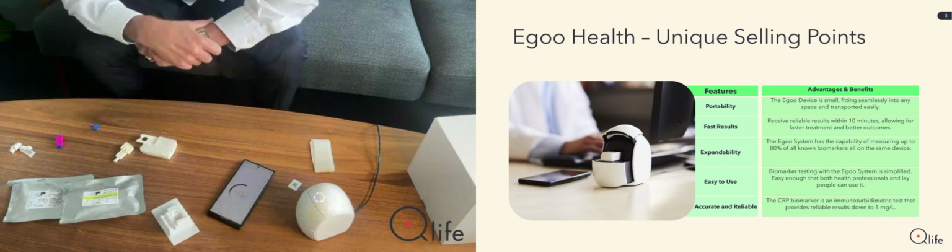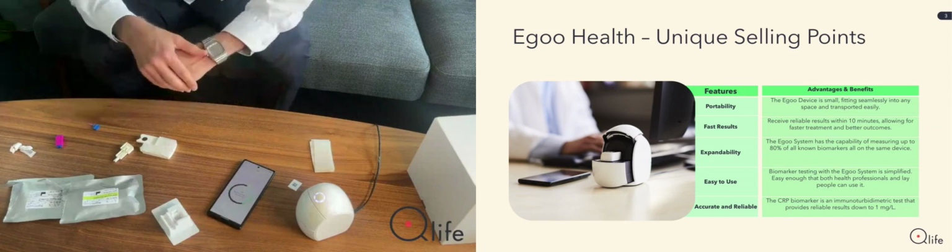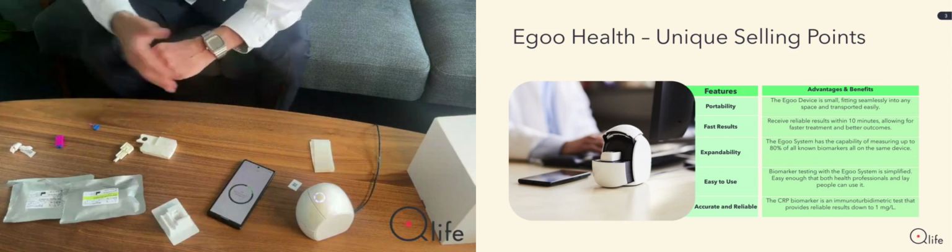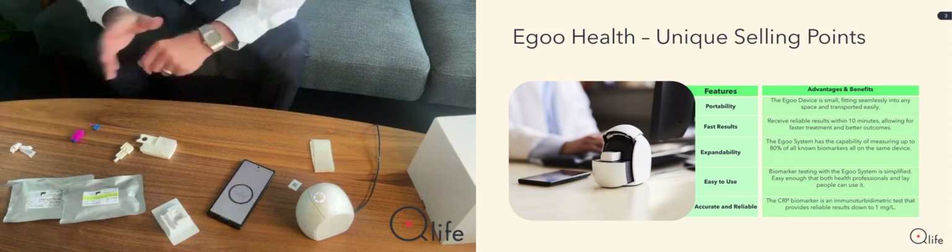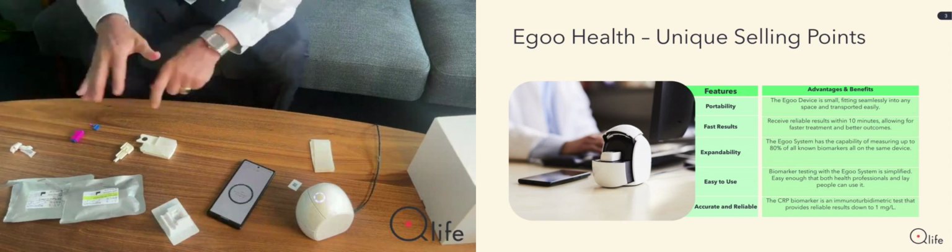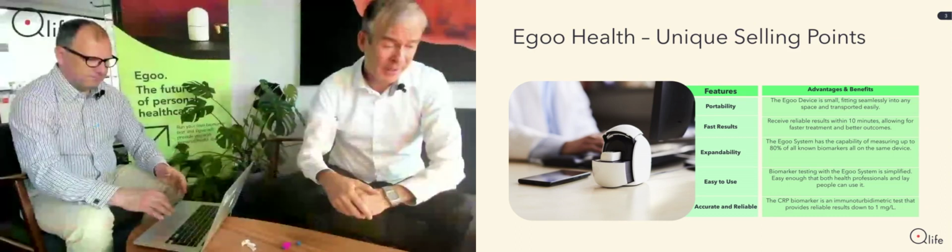And it takes 10 minutes, and that's what it is. So quite easy. It's quite easy. Of course, it requires you to do a small finger stick. And you handle a little bit. I can say, generally speaking, that once you've done it a few times, you become really good at it. So I can recommend, obviously, to do it many times, and then you become an expert. So that's really what it is.